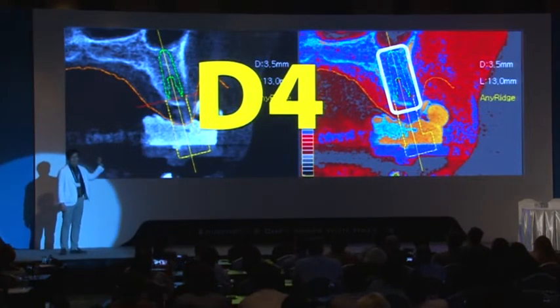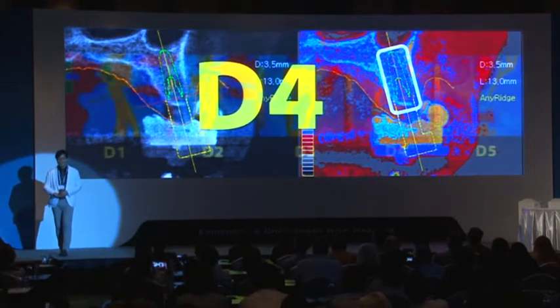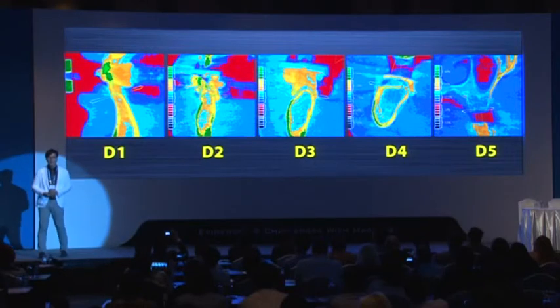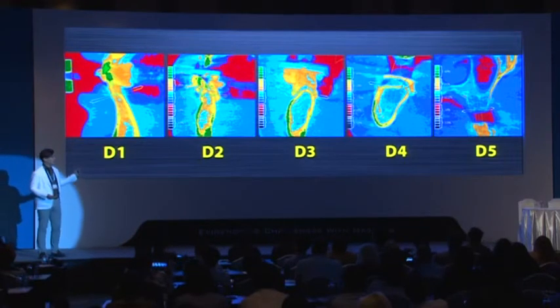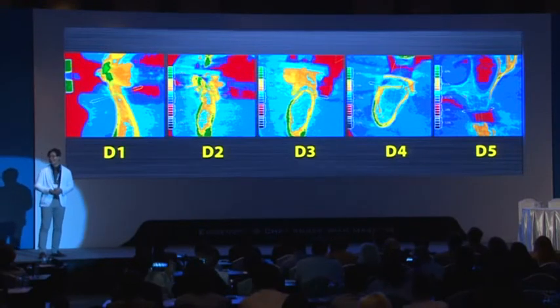And based upon this bone quality, we can make a drill sequence before surgery. Yes, like this. And about this drill sequence and how to get initial stability, Dr. Lee and Dr. Chang-Hun will talk.